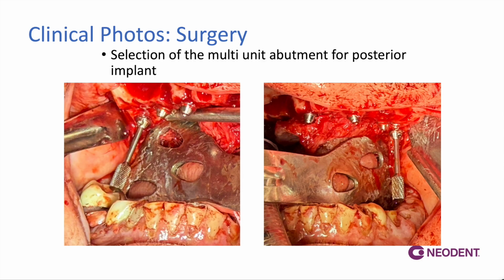And so we're looking across the arch, anterior and posteriorly, medially and laterally, right and left. We're trying to make sure that the path of draw is within the confines of what the system can accommodate, and also maintain a slim and thin prosthesis.